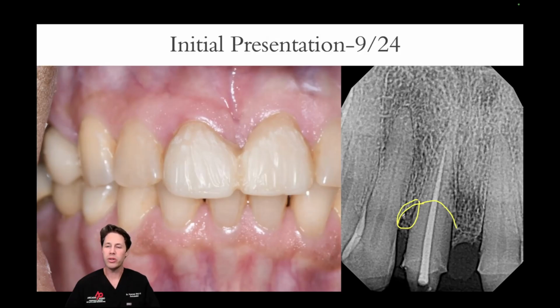The other thing that we want to do in terms of healing is we don't want to place any final restorations until I know how well this area has healed. With this case, we're going to treat this area using a laser assisted regeneration protocol using the LANAP protocol with the PeriLase MVP7 laser. We're going to allow this area to heal for 6 months before taking any clinical probe depths. But what are the probe depths in this case? Well, let me show you.